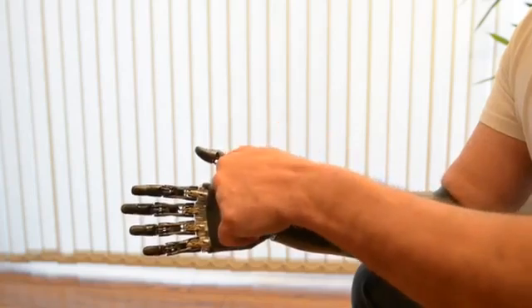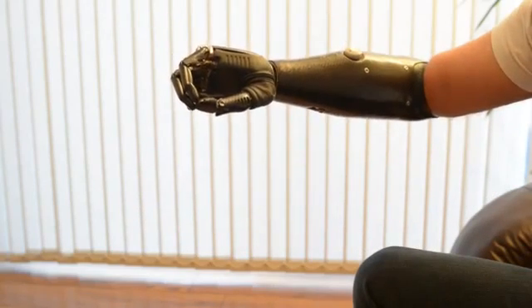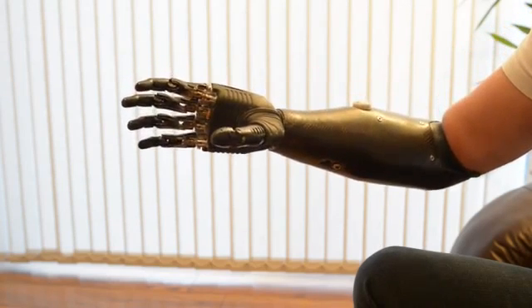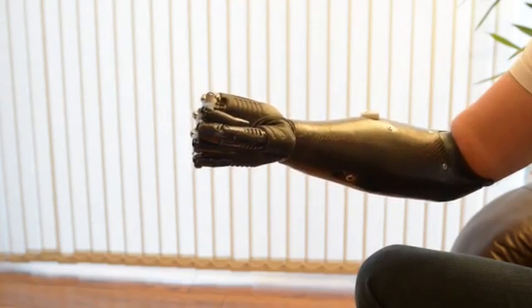We then move the thumb to this position and we can get a tripod grip, so picking up small things. We can then change the grip again. This is power grip — this is for heavy things, this is for shaking hands, this is for being human.